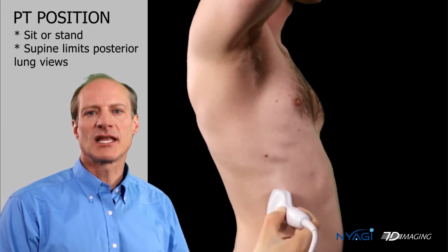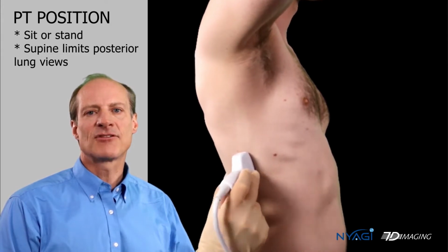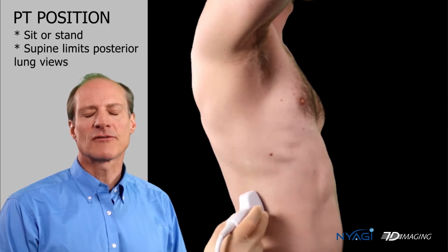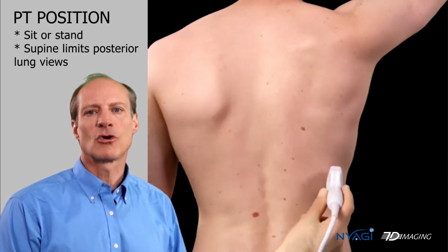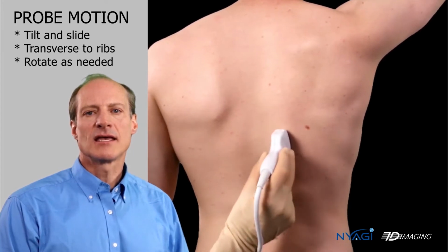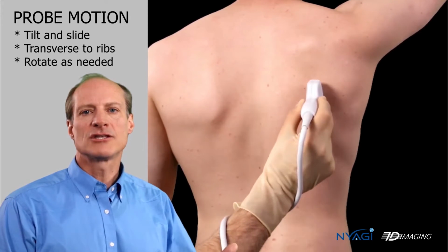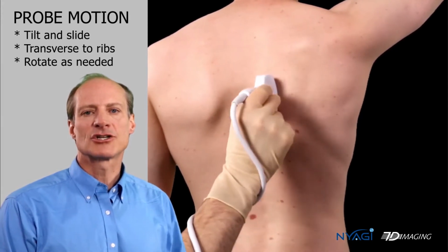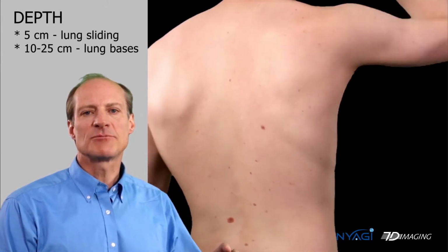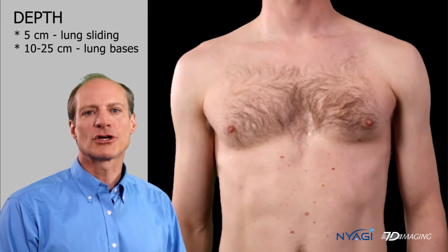Examining the patient in a sitting or standing position may be the most accessible, but if the person is lying in bed, you try to reach the posterior lung fields as best possible, maybe having them roll onto their side. Tilting and sliding is going to be key for looking at the lungs, trying to get the ribs in cross-section so you can peer in the intercostal spaces. Depth may change between 5 centimeters up to 25 centimeters depending on where you're looking.